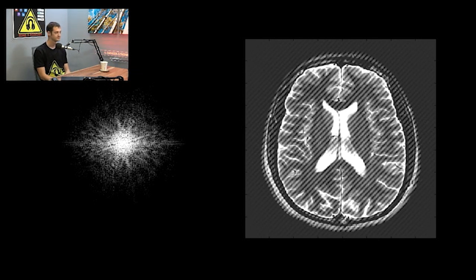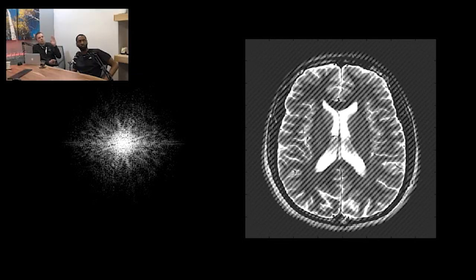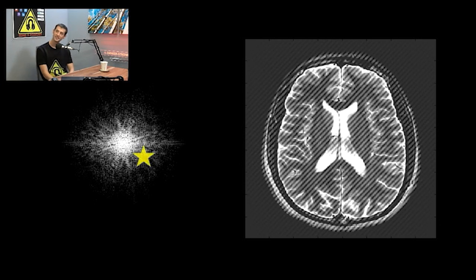I would say that because it's so symmetrical, left to right and north and south, you could get the same artifact from 4 different spots. 2 different spots. So let's show the star. I guess it would be diagonal, the opposite. So it is lower right is where I put it, but upper left would be exactly the same.